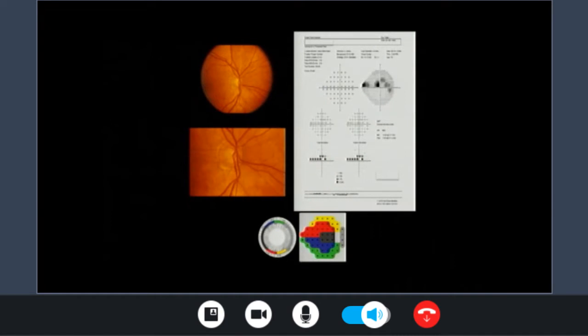So let's start with one test here. That's a printout of a visual field that was done for a patient. Number one, we will ask ourselves, what was done? Here we have a visual field test, which is a 24-2 SITA standard threshold test, white over white. Pupil diameter is there. I'm sorry, it's small. It's 4.4 millimeters. So now we understand what was done. Now we will go for A.